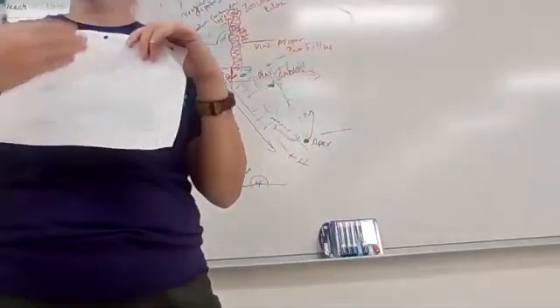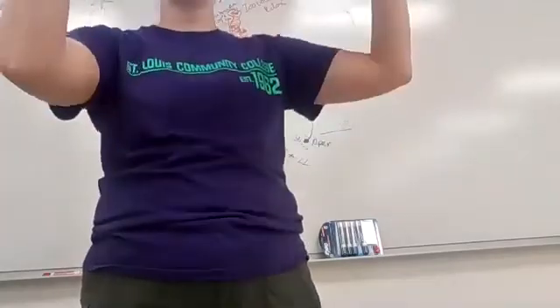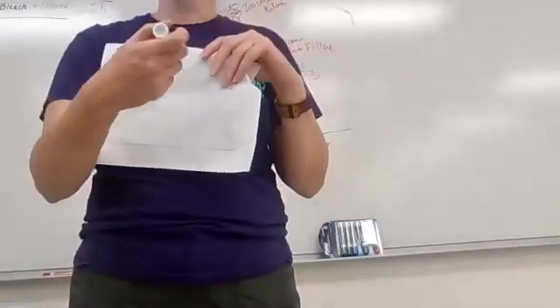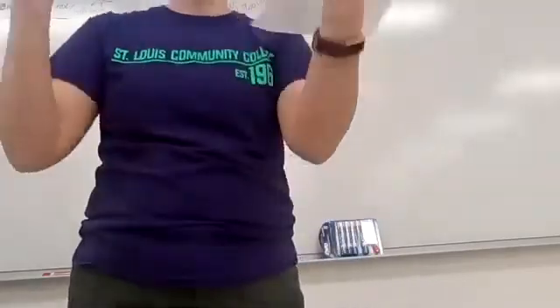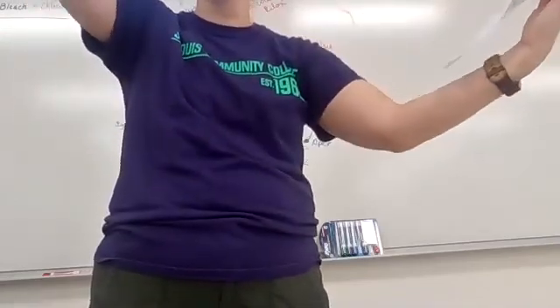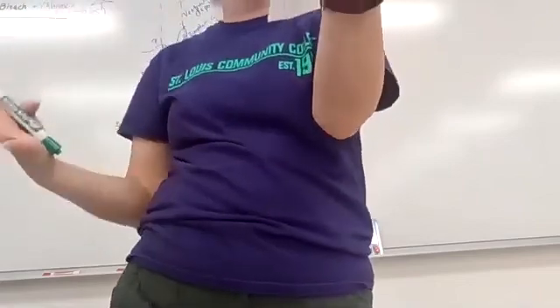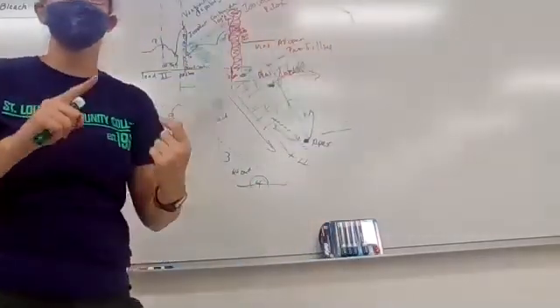The ventricles towards the back end of that wave should be going into diastolic period, relaxing. The AV valve should be getting ready to open. They're finishing their isovolumetric relaxation, right? What are the segments? The P to R segment, again, that time period would be what is electrically happening between the SA node, the AV node, what's happening across the atria. The QT, that's when we know electrically things should be happening between the AV node, the bundle branches, and the Purkinje fibers, and we should see everything happen in the ventricles. Depolarization and repolarization.